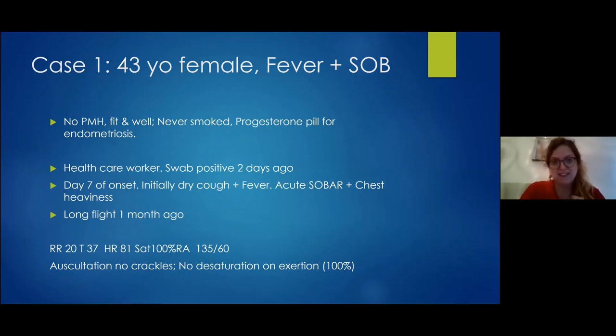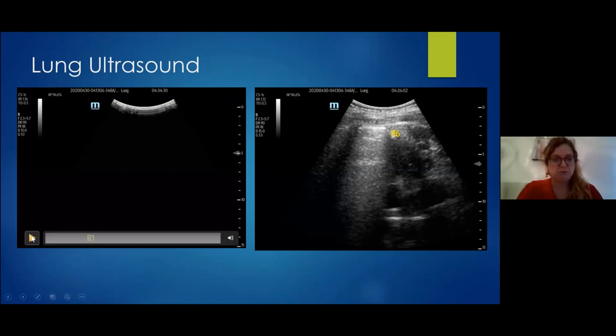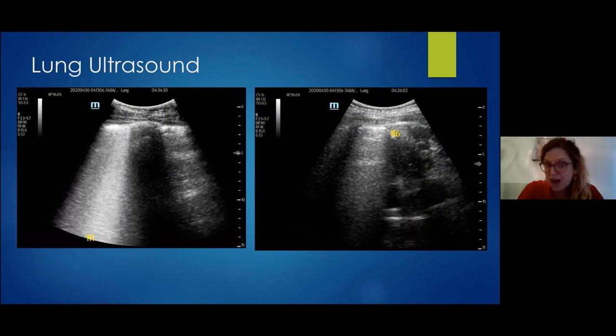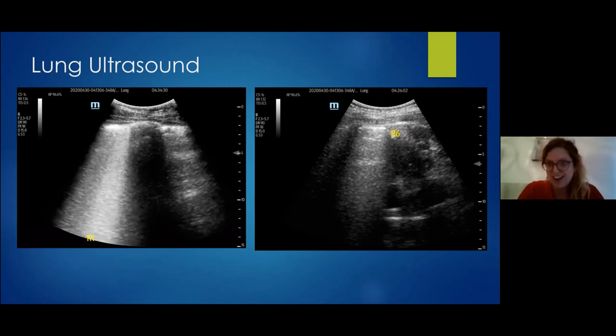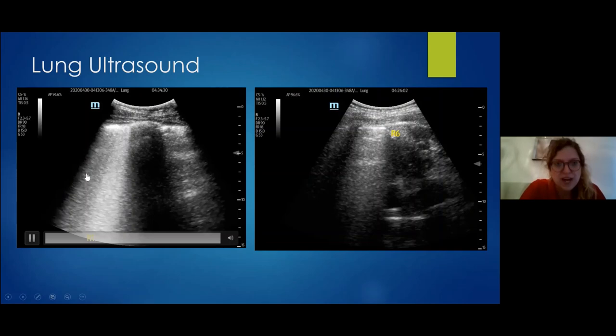We did lung ultrasound right away. This is R1 — she is not known for any cardiac failure. In the first lung zone on the right side of her chest, she had coalescent and multiple B-lines — basically a waterfall appearance. They start from the pleura and go down the screen, keeping the same brightness all the way down.